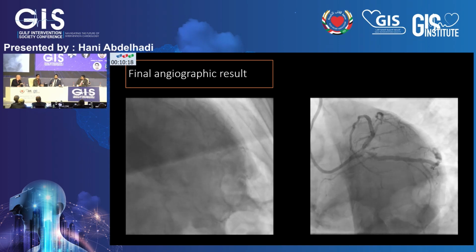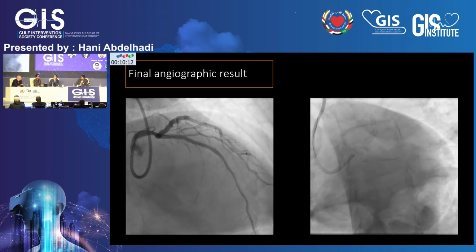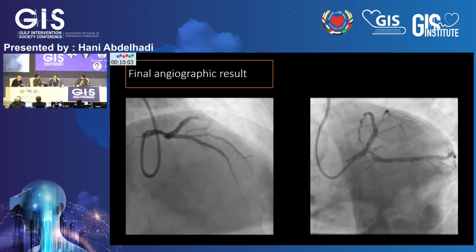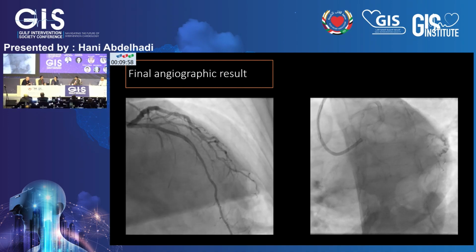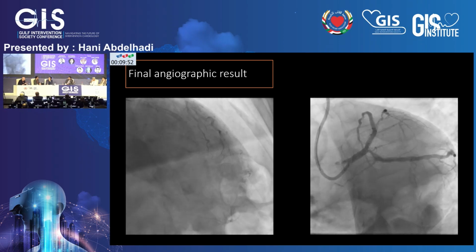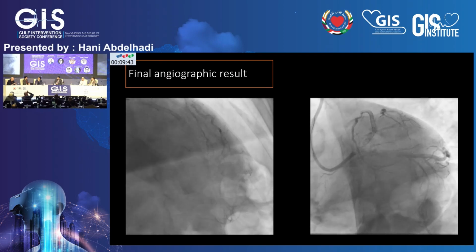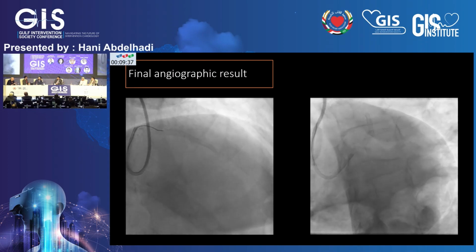Yeah, that's an excellent question, and I certainly don't have the answer. I think we all recognize that the mechanism of balloon angioplasty is indeed to create dissection by definition, so we'll have to learn, using serial intravascular imaging studies, which dissections actually heal and which don't. Typically, at least at the moment, the length of the dissection is what dictates your likelihood of failure. It's not actually the arc of the flap. Now, unfortunately, from the ROC curves, that length of dissection is relatively short, 13 millimeters or so. So if you have that length of a dissection, it's likely to heal poorly.